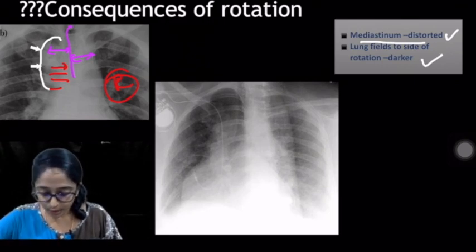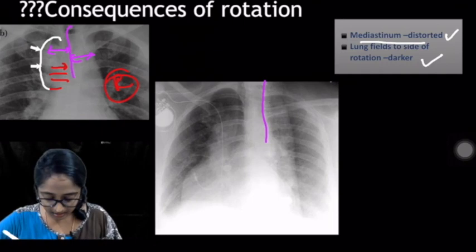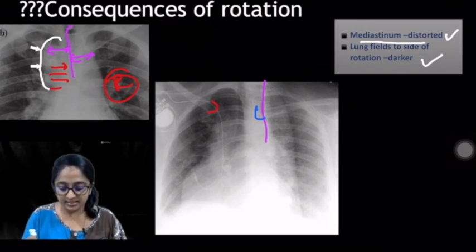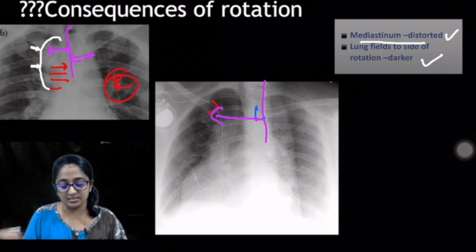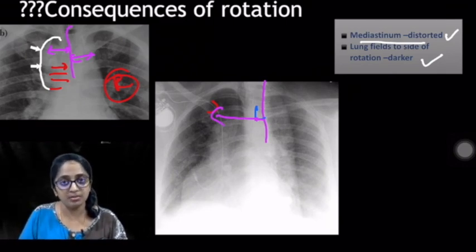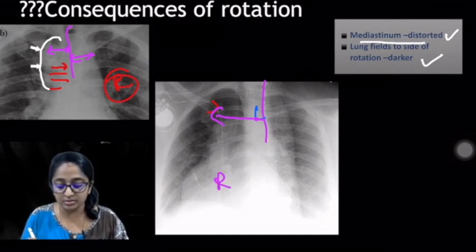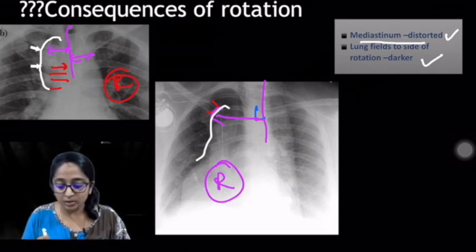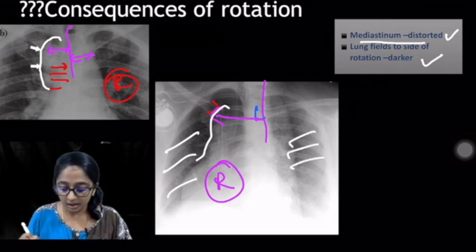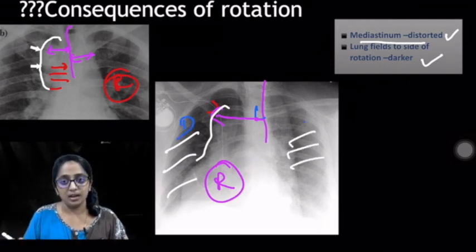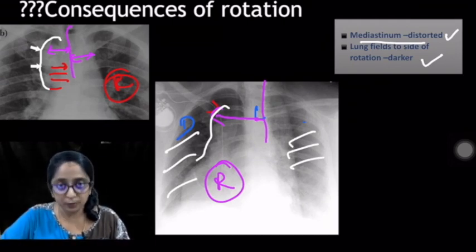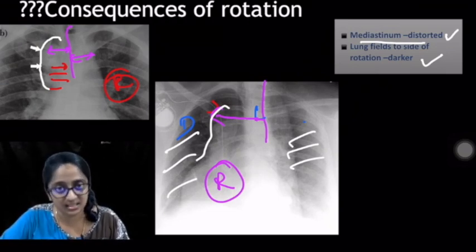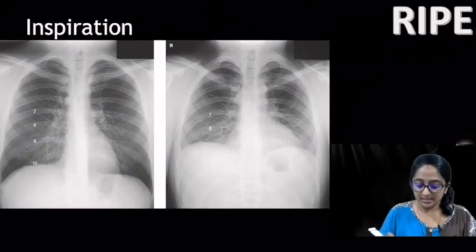In the next image, the spinous process and medial ends of the clavicles show the right clavicle is further from the spinous process — so the radiograph is rotated to the right. Other than the distorted mediastinum, you can see the right-sided lung fields appear darker than the left. So with rotation, mediastinal structures on that side appear distorted and magnified, while the lung fields on that side become darker.